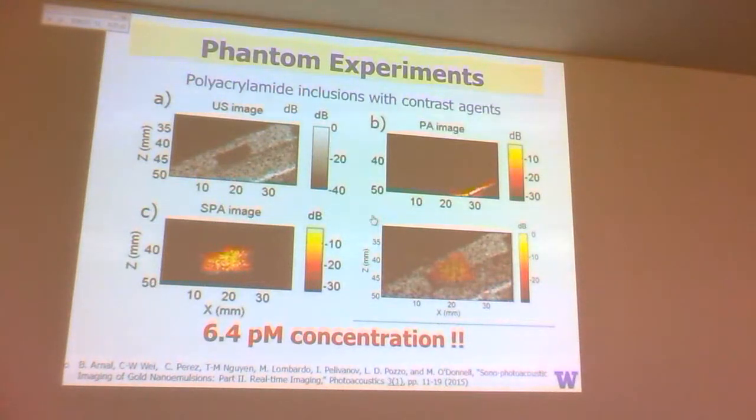Okay? Why do I see nothing in here? I'm at picomolar concentrations, and if it's just linear photoacoustics, I told you I have to get up at nanomolar before I can see anything. Right? By just using the thermal expansion of water. Okay. If I use that trick of this plus-minus phase, I can make an image where now that image only shows the region which is the residual, which is exactly where the contrast agent is.